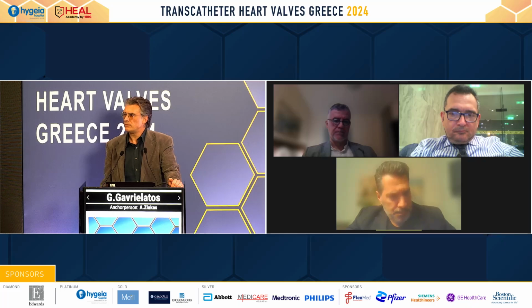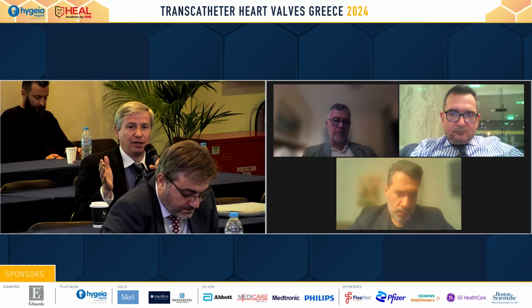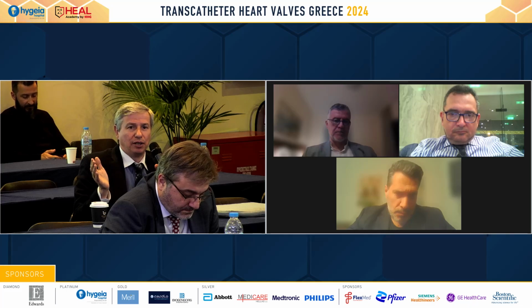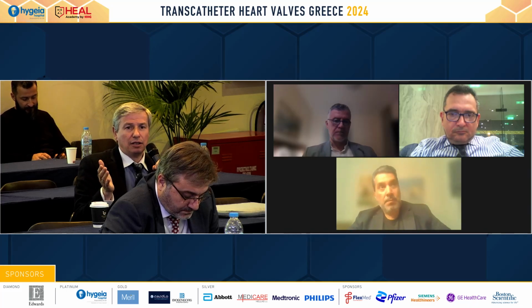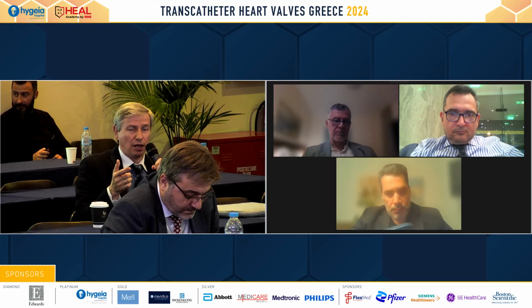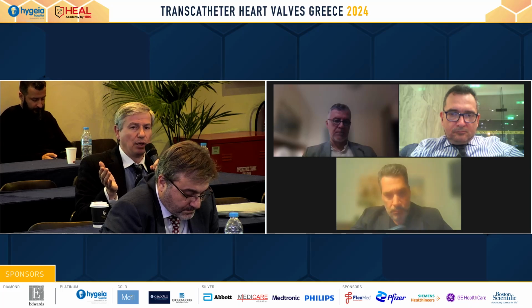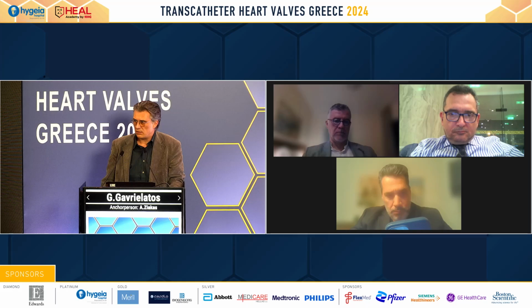Fantastic case. Very, very nice case. Thank you. I think there is no question in my mind that this PFO should have been closed because it proved itself. There was a large thrombus there that, no matter where it came from, it was there. So it should be closed. And I think 6 weeks after very intense anticoagulation it can be closed pretty much safely. I agree with you, but it is a debate in the literature. That's why I mentioned that. But it is the best for the patient, I think.